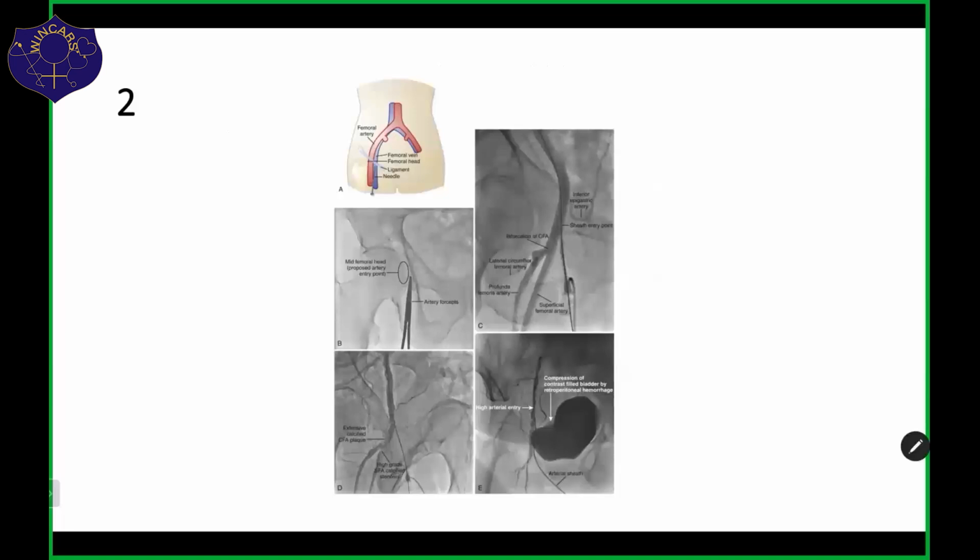One of the best ways of eliciting it is deep palpation in the right iliac fossa. If you palpate deeply, patients do complain of tenderness. So here what you can see is the angiogram is being done. As you know, once the angiogram procedure starts and we inject the dye, within a few minutes the dye gets collected in the bladder. So here, in the superior margin of the bladder, there is some irregularity or impingement which is caused by the retroperitoneal hematoma.